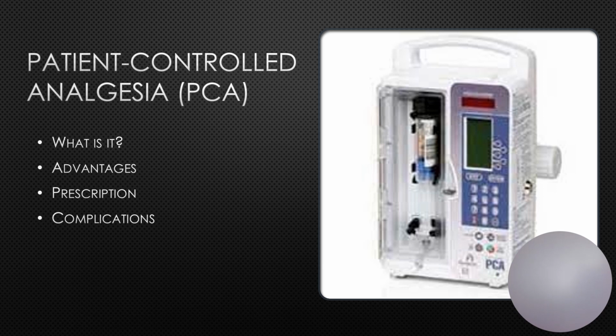The order or the prescription will require a loading dose. So how much are we going to give initially? What is that lockout interval? In other words, the client receives a dose, how long before they can receive another dose when they are pushing that button? Sometimes we will have a maintenance dose. We'll be giving a continuous dosage. We will have an individual dose. So every time the button is pushed, they'll be getting a certain amount. And they also have a maximum amount that a client can receive within a specified time frame.